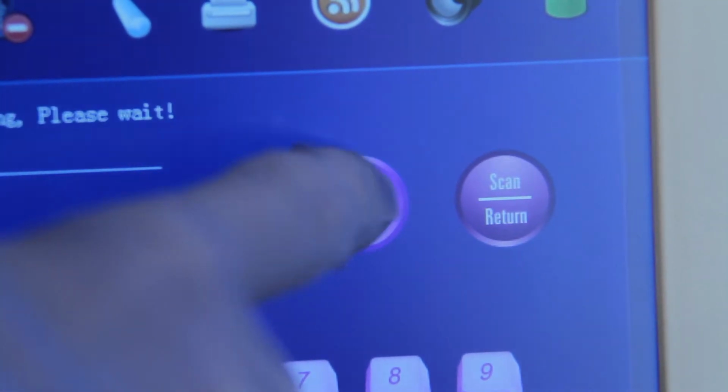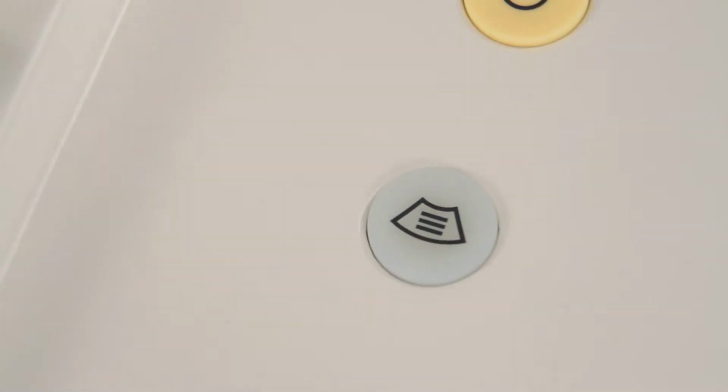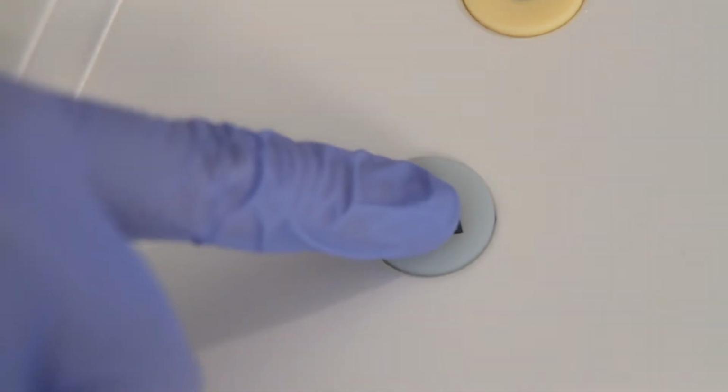Press the printer key on the control panel to print the current images. Press the scan key to return to the pre-scan screen. Then scan by pressing the scan key again.